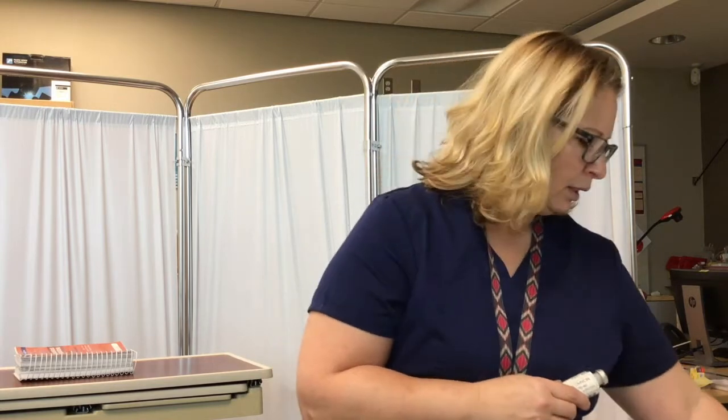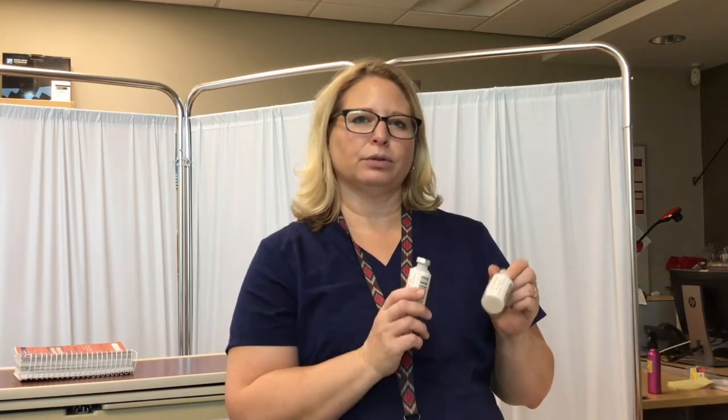We are ready now, finally, after all of that prep, to get our meds ready and give them to our patient. The first scenario we're going to go through is that Armando's arm has a saline lock, okay? So we are going to give our vancomycin and our furosemide through a saline lock. You can see that when you're looking at your IV med list, there's a procedure for existing line and saline lock for both of these.